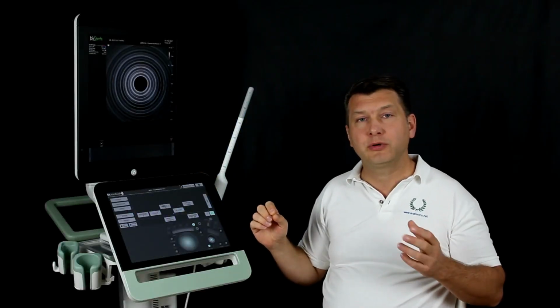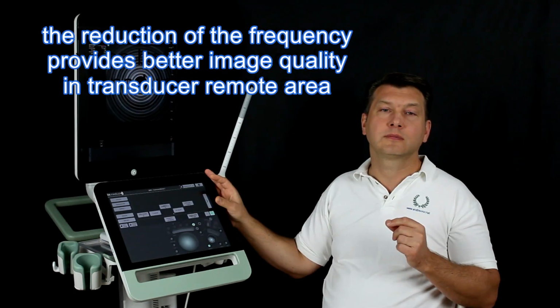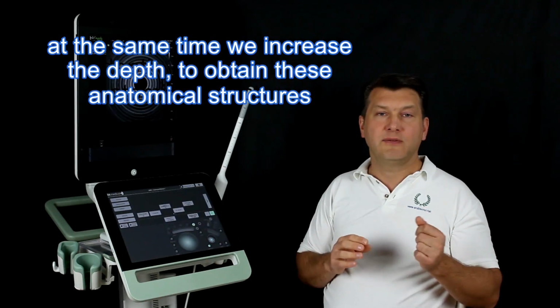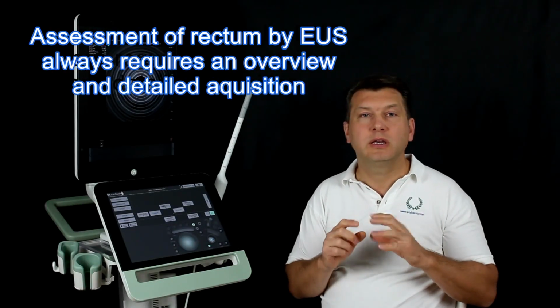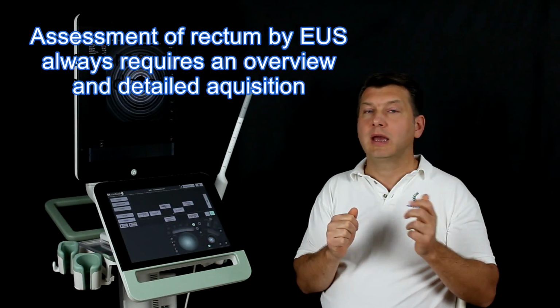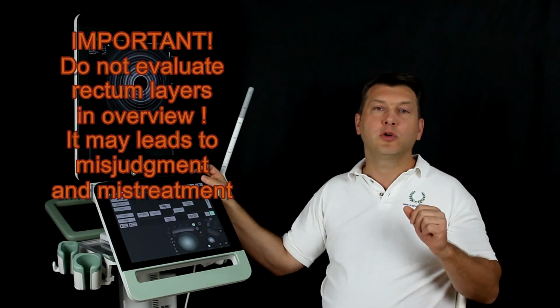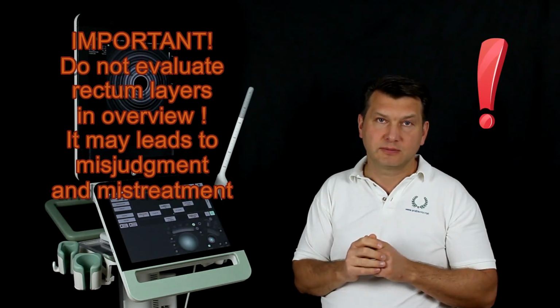In overview display, the frequency should be reduced to improve the image of the probe-remote areas. At the same time, the depth is increased. Other values may remain unchanged. In order to assess the rectum, it is necessary to carry out a double examination, an overview and a detailed examination. It is important not to assess the rectum wall layers in an overview. This leads to misjudgments.